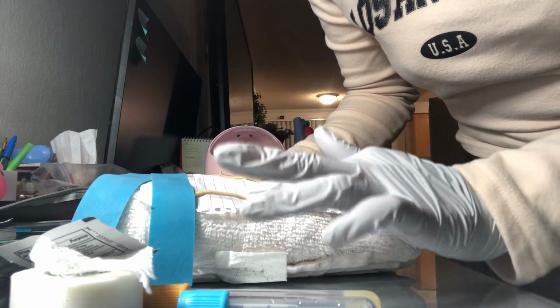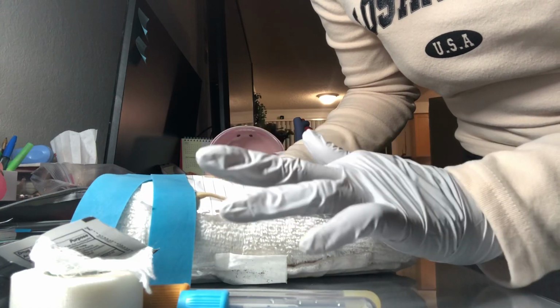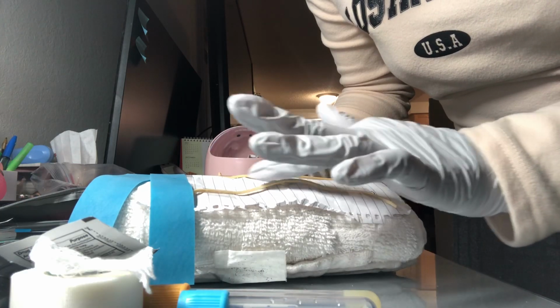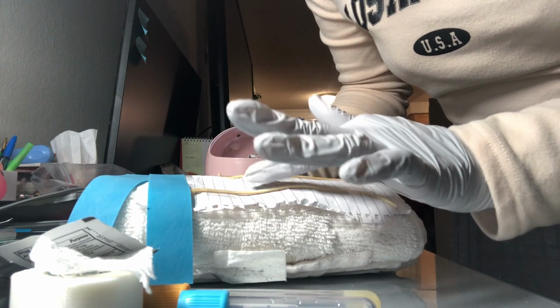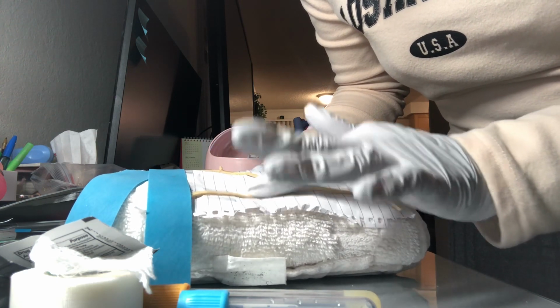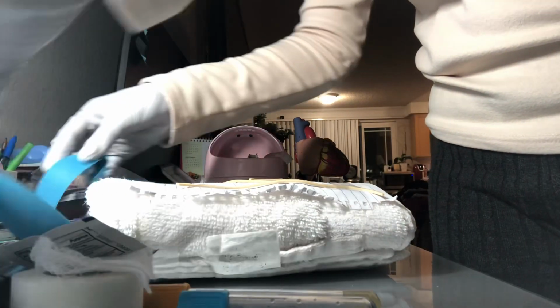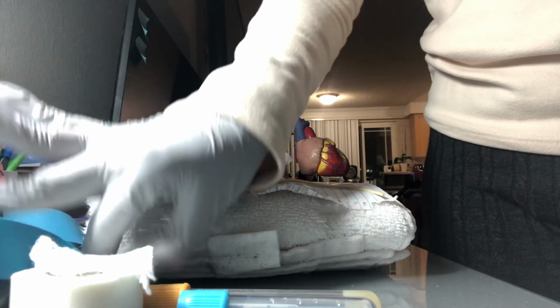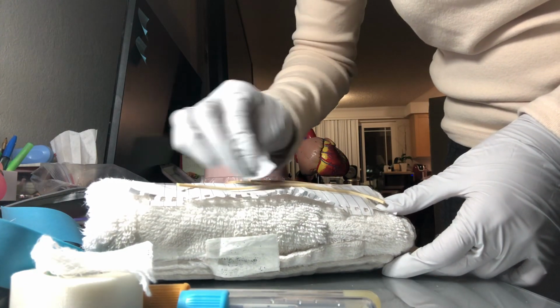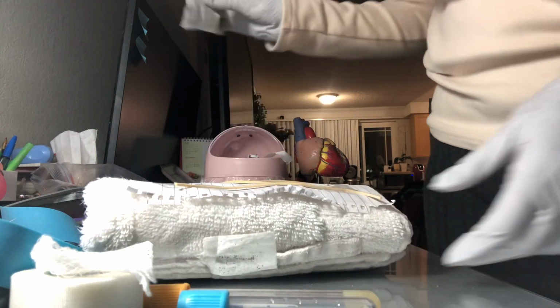Okay. Now moving the finger up and down, I can feel the vein's depth. By rubbing it, I can feel the vein's size, the vein's shape. Okay, I'm going to release it and apply alcohol back and forth at the intended venipuncture site.